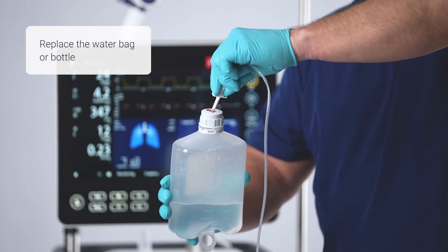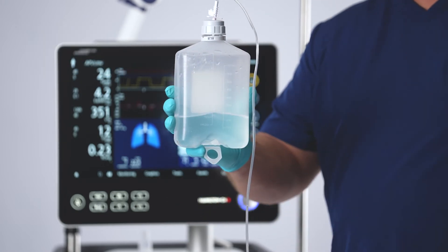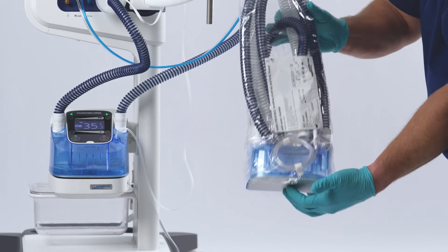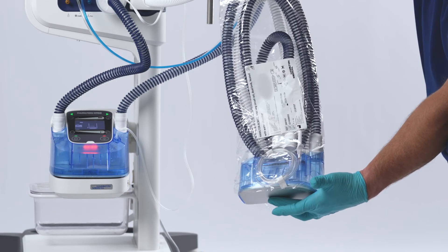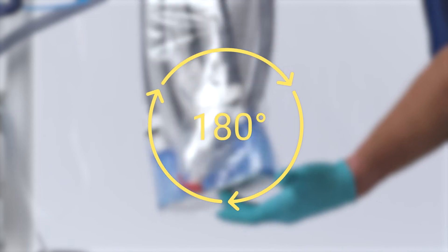If the water bag or bottle is empty or almost empty, replace it to ensure the water is being supplied correctly. If a new chamber is needed, be sure to check it once the packaging is removed and before inserting it into the humidifier. To ensure that the float is free, flip the complete kit upside down, then flip it back up again.